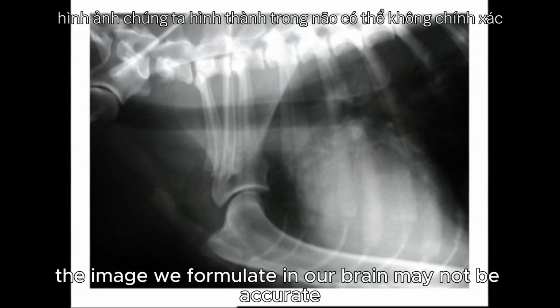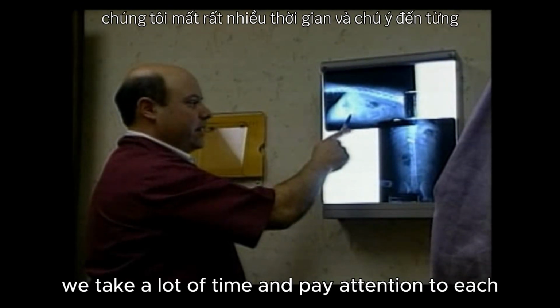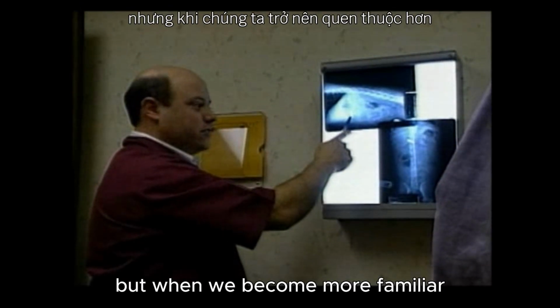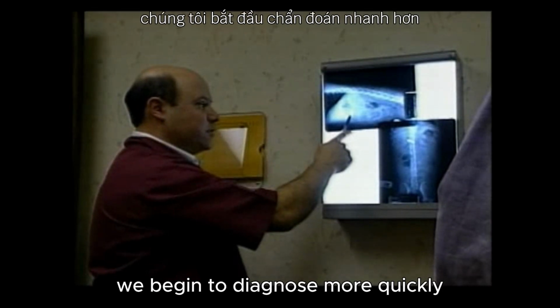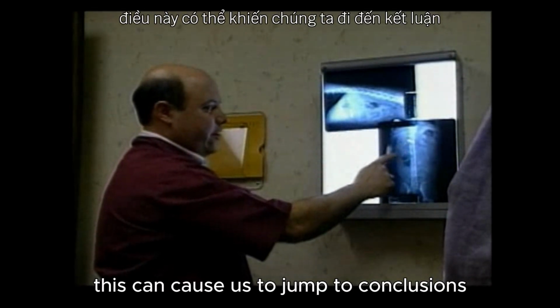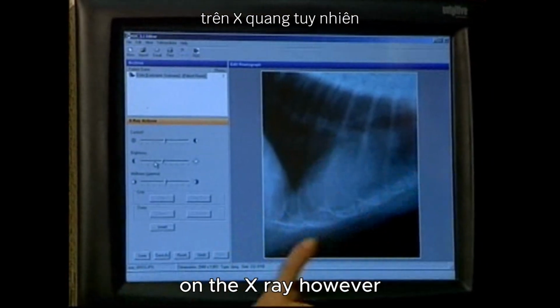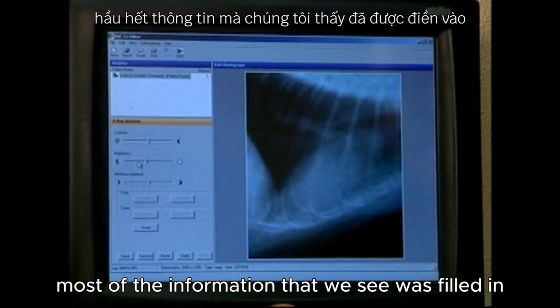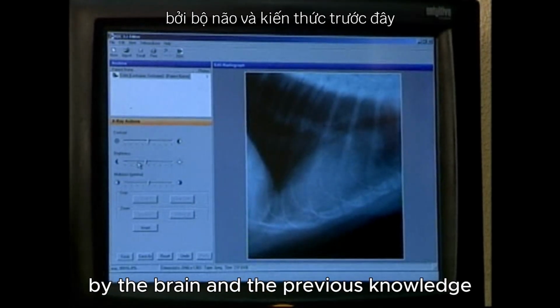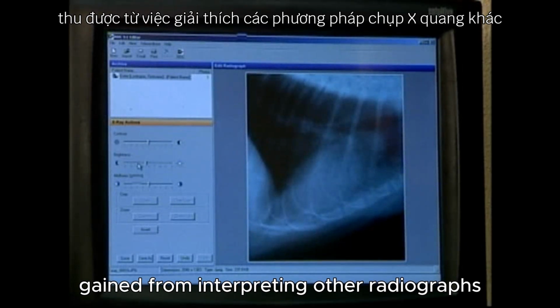may not be accurate. When we first start to read X-rays, we take a lot of time and pay attention to each, but when we become more familiar, we begin to diagnose more quickly. This can cause us to jump to conclusions, feeling that we have perceived all of the information on the X-ray. However, most of the information that we see was filled in by the brain and the previous knowledge gained from interpreting other radiographs.